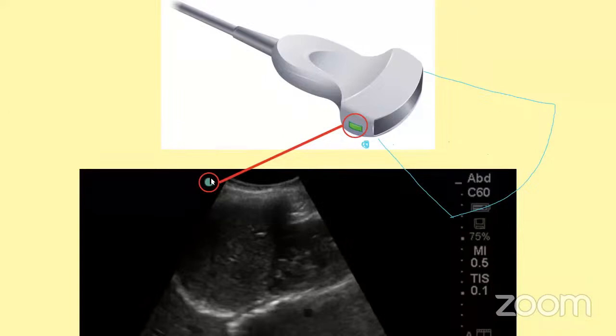Are you able to appreciate it? So this probe orientation marker corresponds to the dot or the logo on the ultrasound screen. And this is the plane in which the ultrasound pulses should be generated and transmitted. Good?